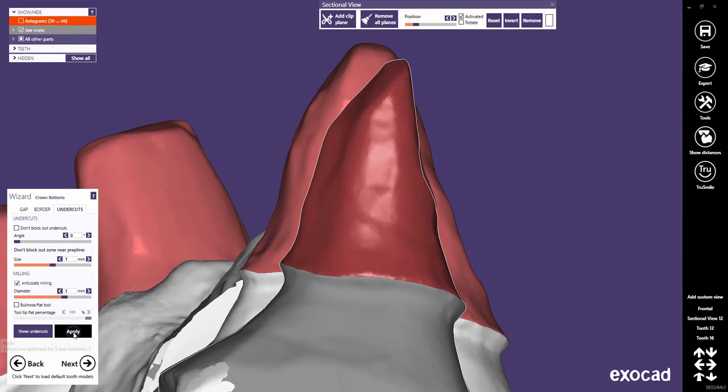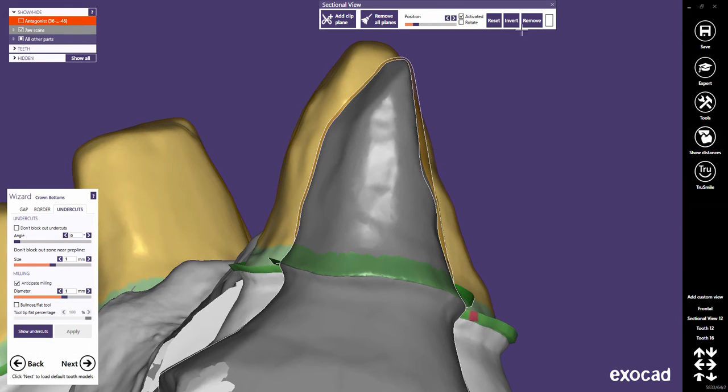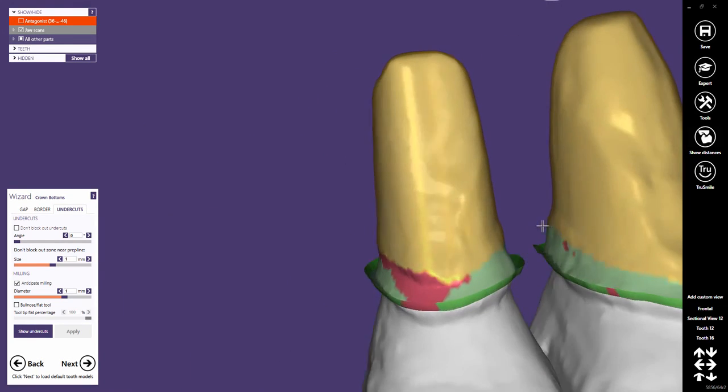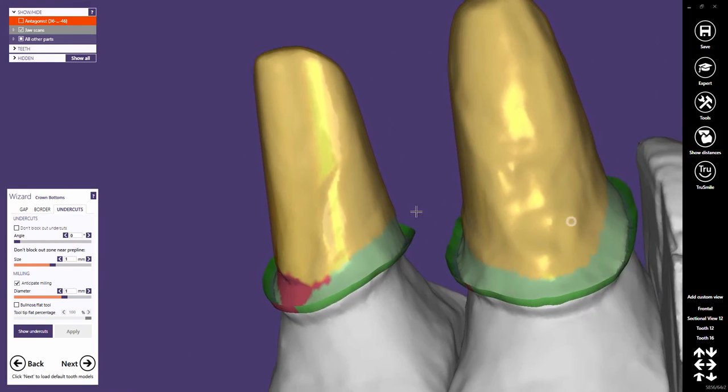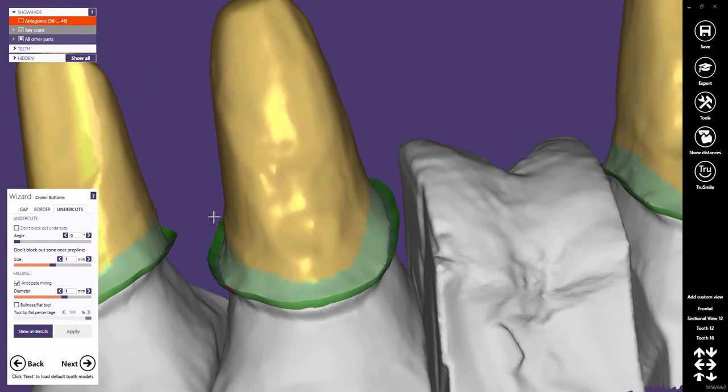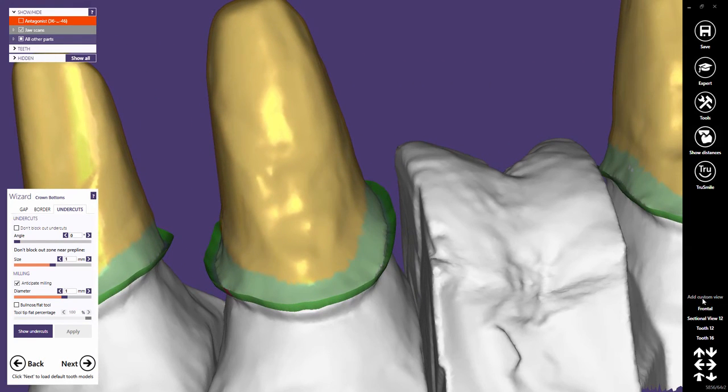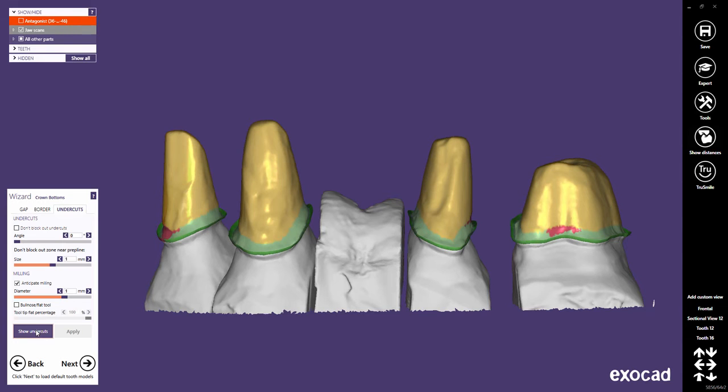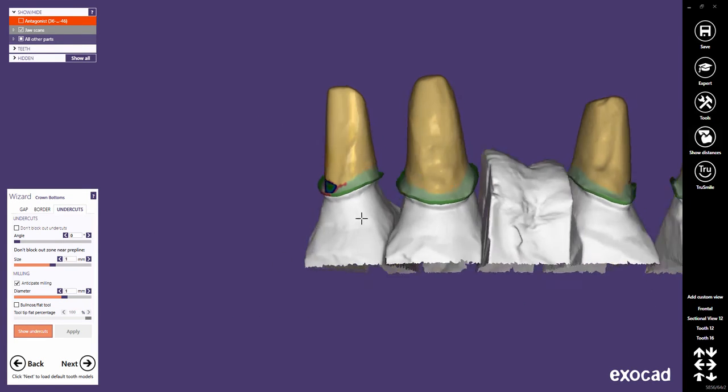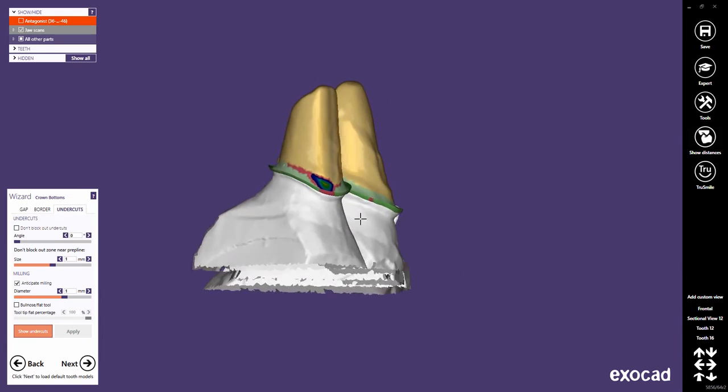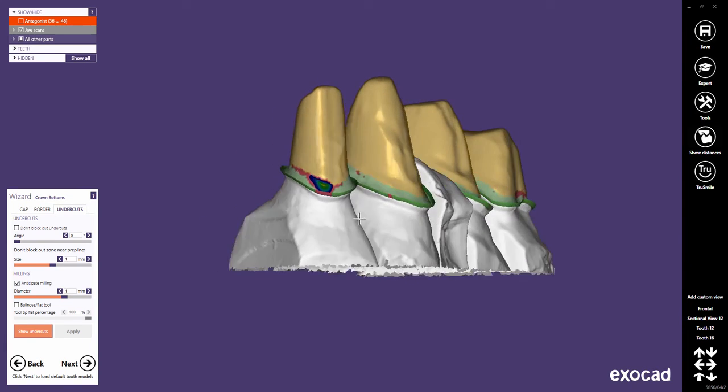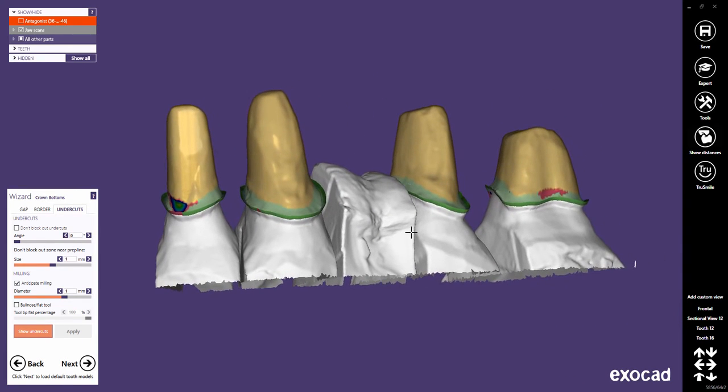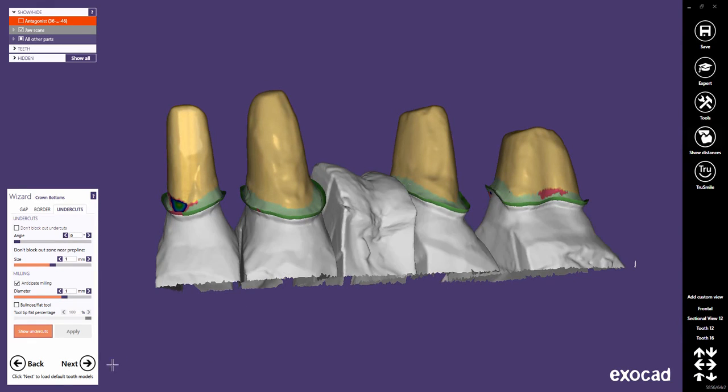Let's come back to the default setting. The button Show undercuts leads to the cement gap undercuts being displayed with a color scale. Note, if at any point in this step you find that the insertion axis is not optimally defined, you can still easily change it in the right mouse context menu. Now you can proceed to the next step.